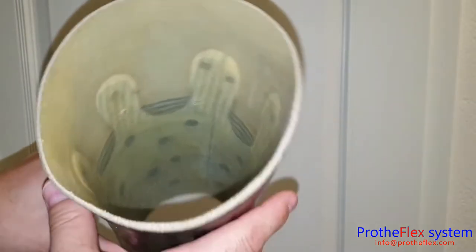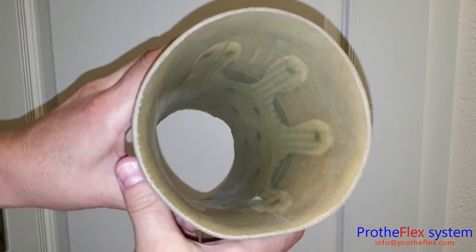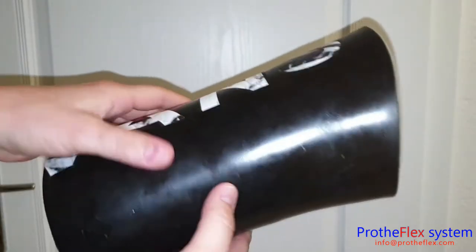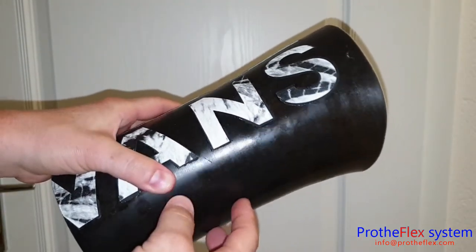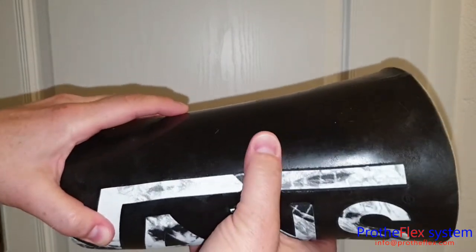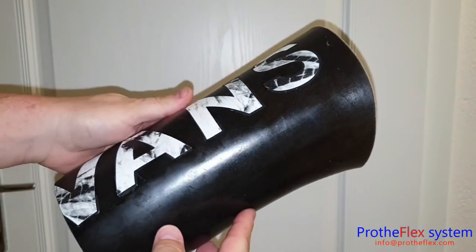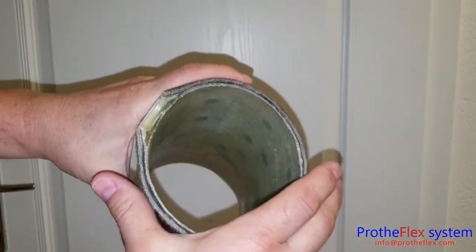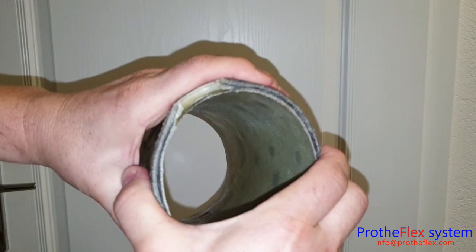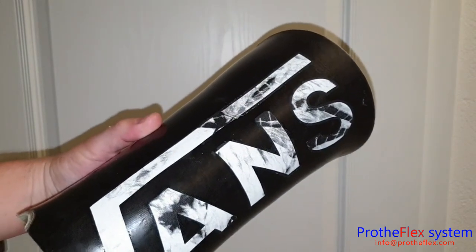This patient is actually a very young man and he destroys everything he gets — prosthetic sockets or whatever. But this protoflex system works well for him, and now he wants more of it.